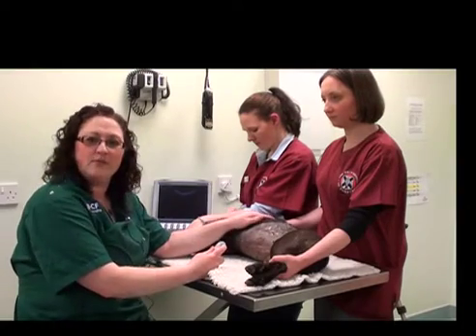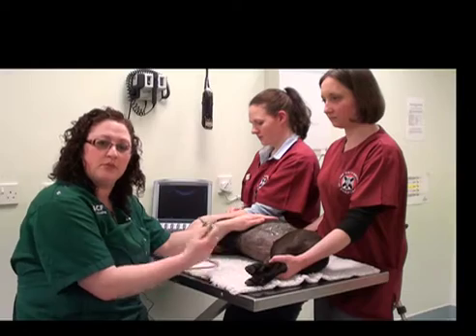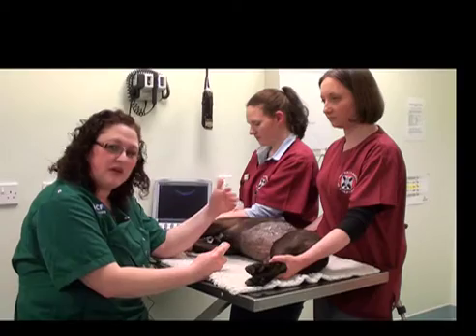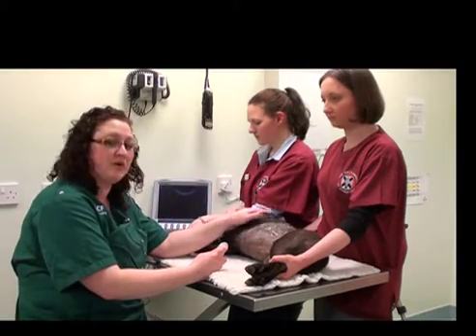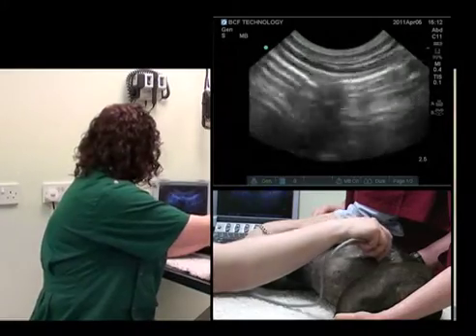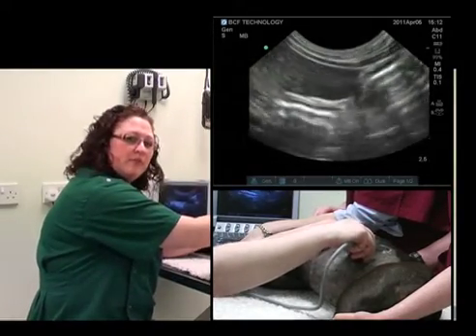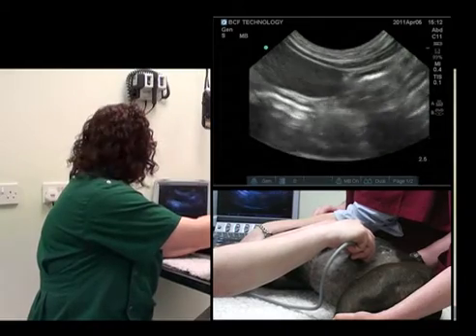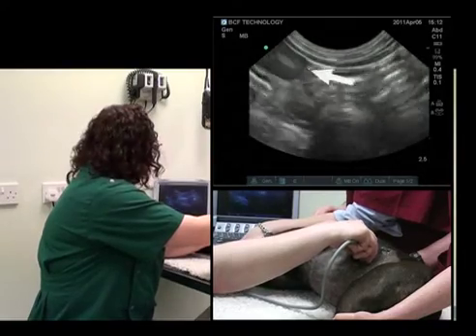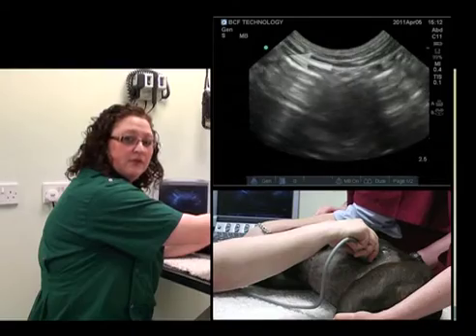One of the motions that you can perform with your ultrasound probe is pressure. The spleen is not a fixed organ — the tail is actually quite mobile, and the body as well. So when you're looking at the tail in particular, it's important to remember that motion of pressure. As you can see here, I'm not moving the probe, but simply applying pressure, and the spleen goes out of view on the screen.